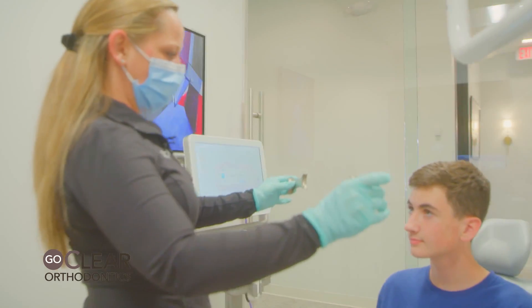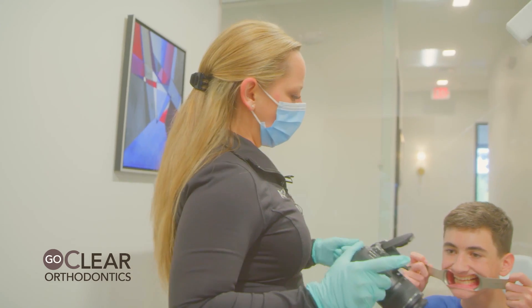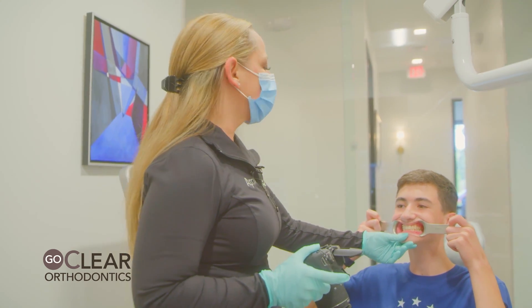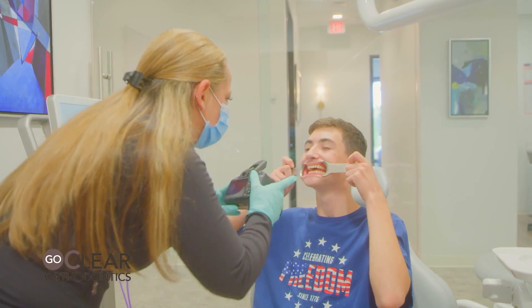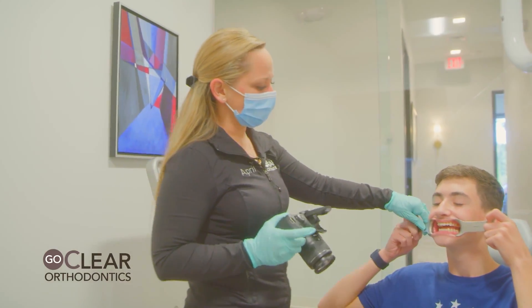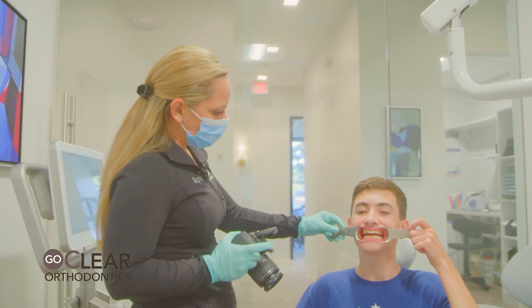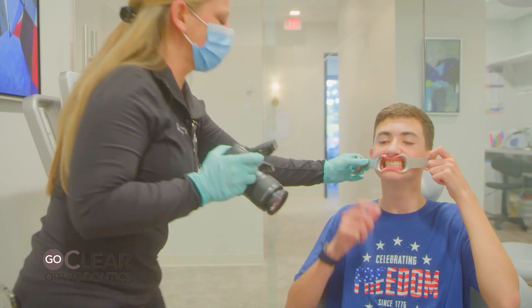We're going to do one in each cheek — pull them apart and bite down. With a cheek retractor in each cheek, pull it apart. He bites all the way down. Put the patient's head where you need it — chin up a little and turn towards me some. Now we're going to get the buccal. You hold the left side but don't pull it. Bite all the way down.